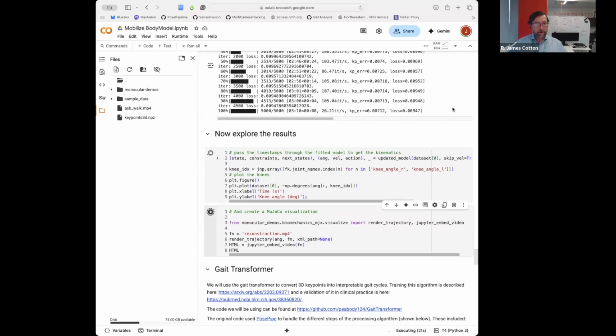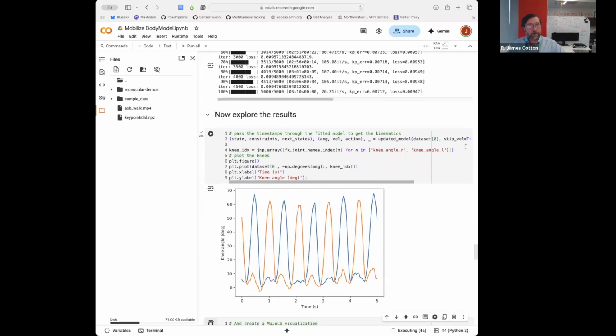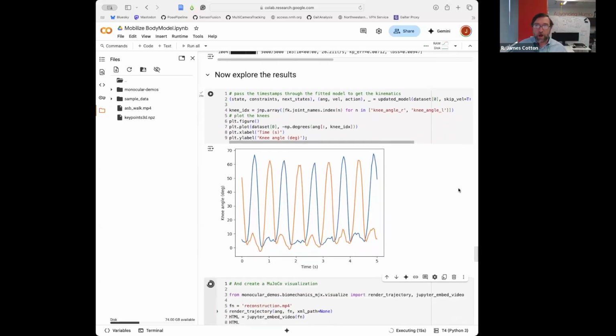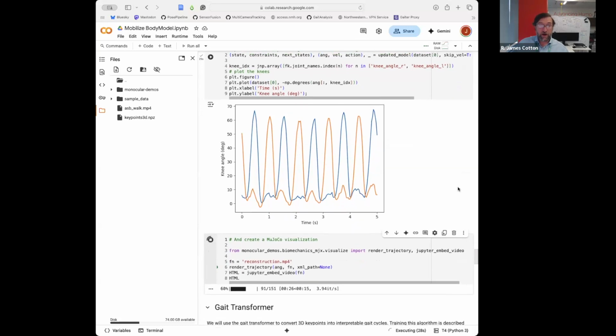We don't know what the accuracy needs to be. I'm really interested in precision rehabilitation and neuro rehab, and we don't know what level of precision you need to measure someone in order to make good predictions in clinical decision making. So we need to do that research. I don't think it's going to be tracking every toenail to micron precision, right? I think there's going to be some sweet spot. I hope we're at the sweet spot. If we're not, that's why we continue working on next generation algorithms, right? And we've got some fun things in the works. But I think we're at a place where, if we can't find interesting clinical things at a couple of degrees, it's possible they're just not there.